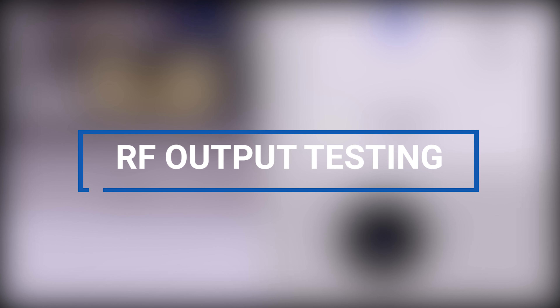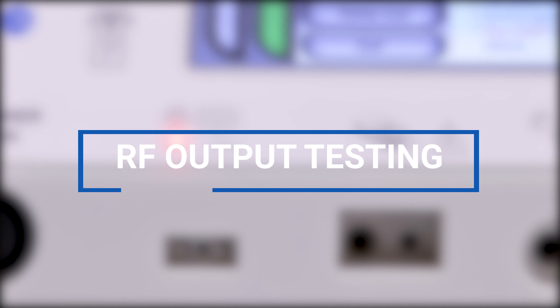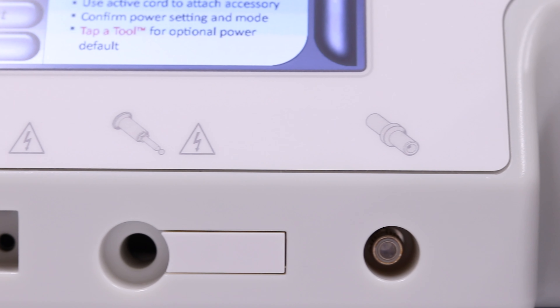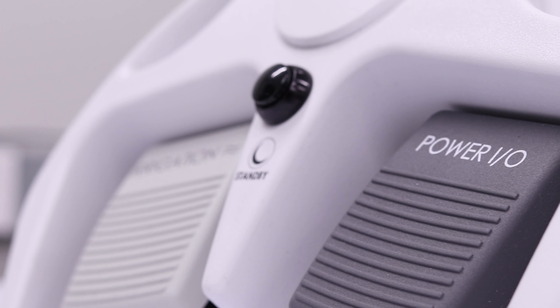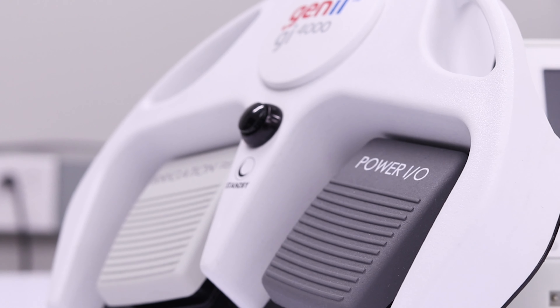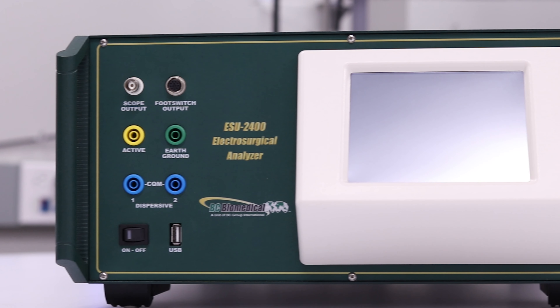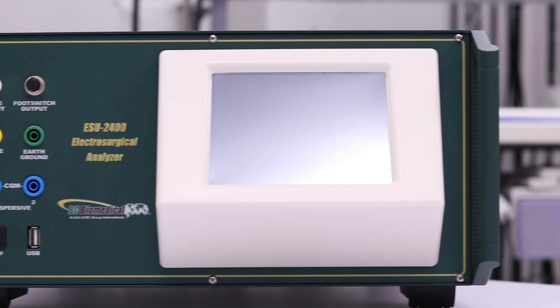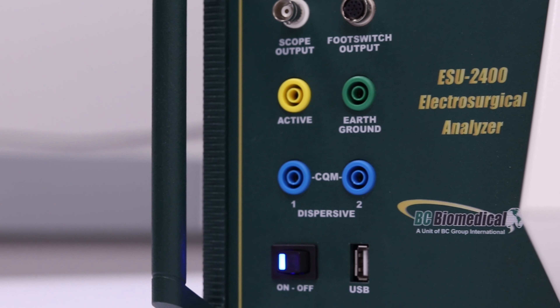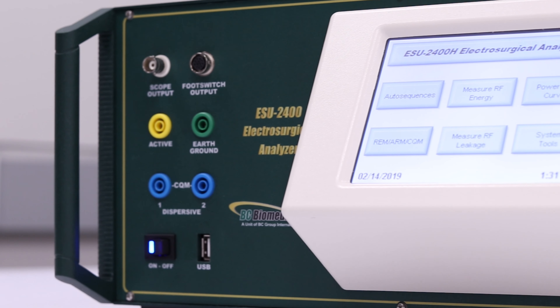Hello, thanks for tuning in. In this video, we will be discussing RF output testing for the GI-4000 ESU. More specifically, performing radio frequency power output testing with the ESU-2400 electrosurgical analyzer. Electrosurgical generators, like the GI-4000, often require periodic RF output testing in order to verify the device's safety and performance specification standards.